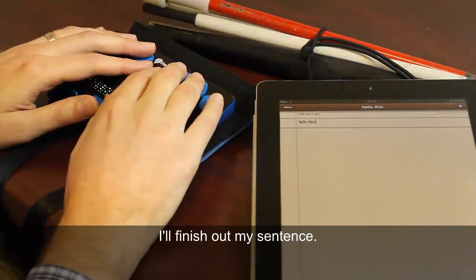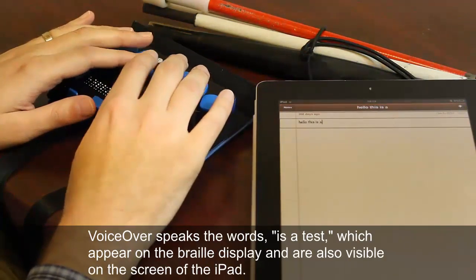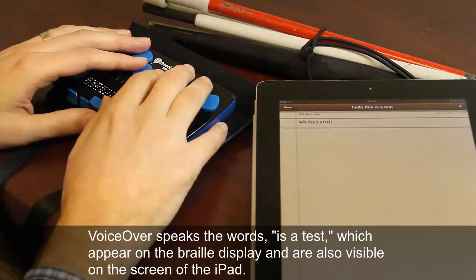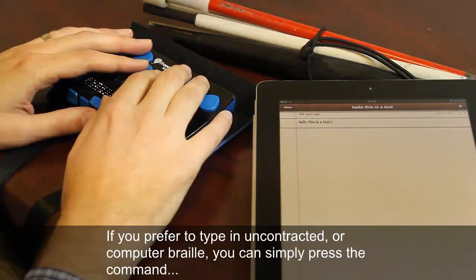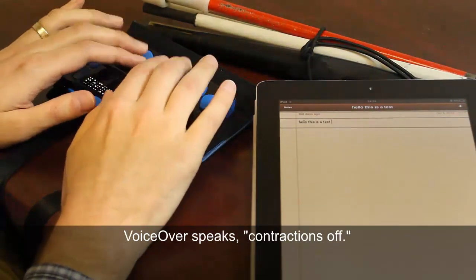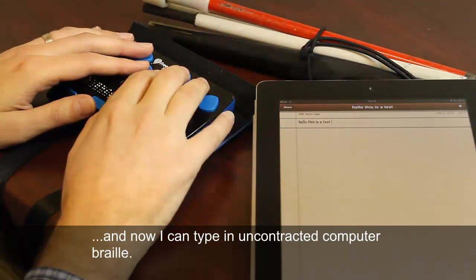I'll finish out my sentence: 'Hello this is a test.' If you prefer to type in uncontracted or computer Braille, you can simply press a command — Contractions off — and now I can type in uncontracted computer Braille.